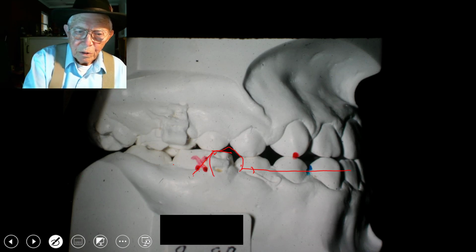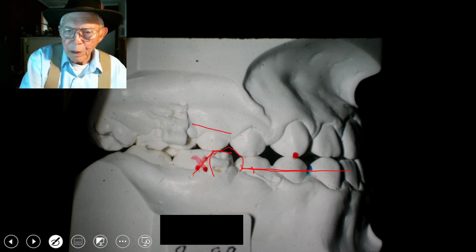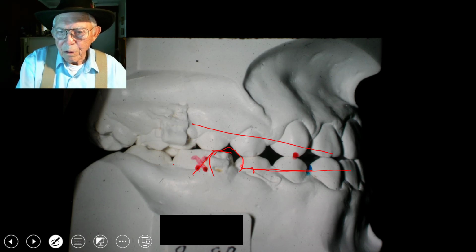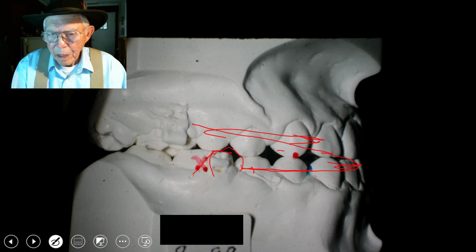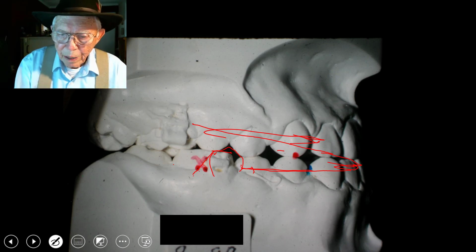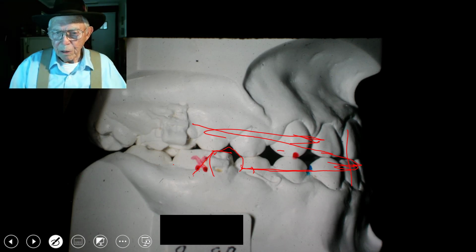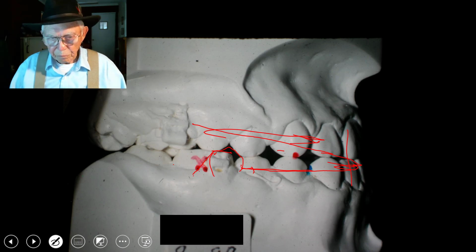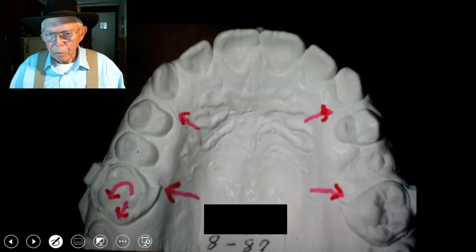And then as we pull this back right here, we're also going to be pulling this coming off, pulling this back by pulling the upper teeth forward. And then this right here will actually bring this back more, and we're going to correct the whole class 3 problem by pulling in both directions in there. Okay, here, let me adjust that a little bit, and we'll go back in.